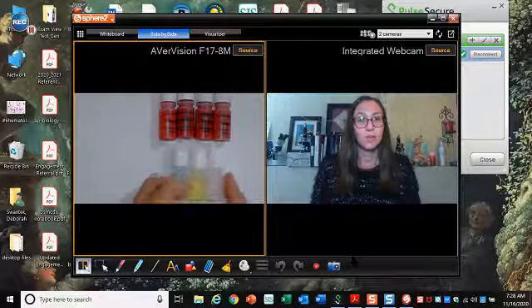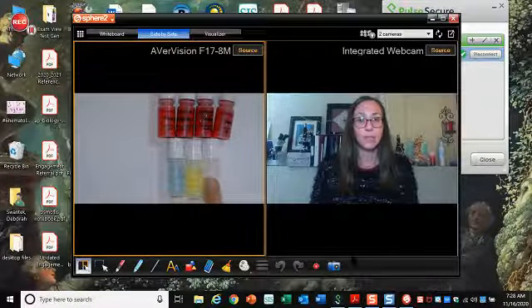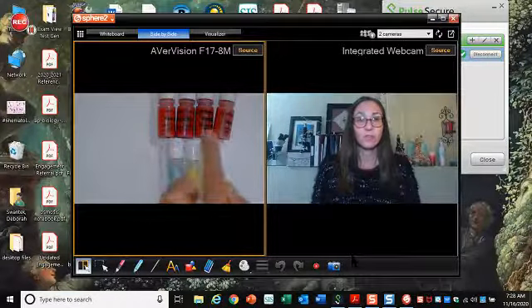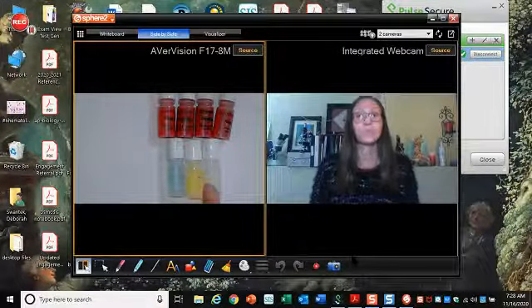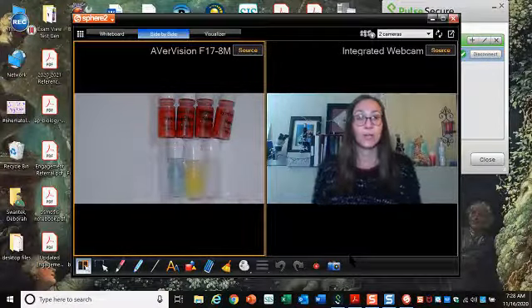So we're going to be using these man-made antibodies to determine what antigens are present on the surface of these 4 samples of red blood cells. When we understand what's called the antigen-antibody reaction, we can use that knowledge to determine an unknown blood type.